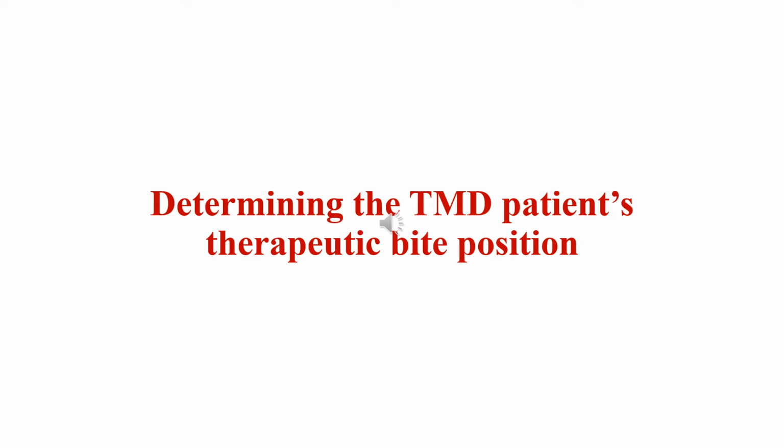So when the brain bites into hard plastic, it thinks it's teeth. And so we're fooling the brain into believing that that's the bite. And there's a whole bunch of things that happen when you put the correct bite into position. And the correct bite's the therapeutic bite, therapy bite.